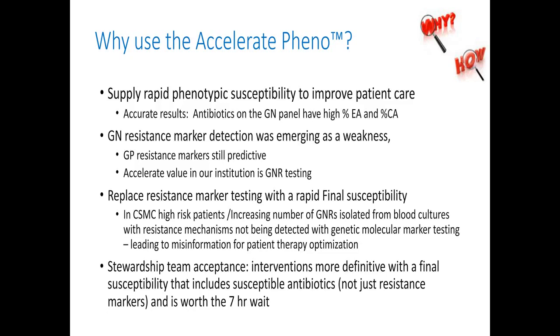I would go to the literature and see if there's any literature on the topic. If I'm attending a meeting, I would make sure to drop by the booth that is actually selling that equipment and see if I can see it firsthand. And it always helps to talk to users if the equipment is out in the field yet. So will the results from this instrument be useful in your institution, and particularly with your own patient population?